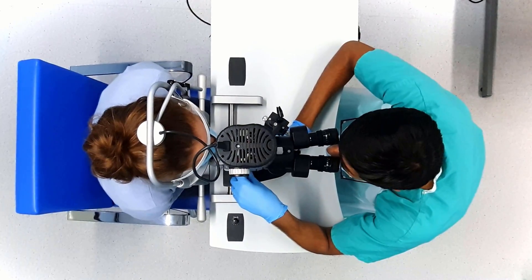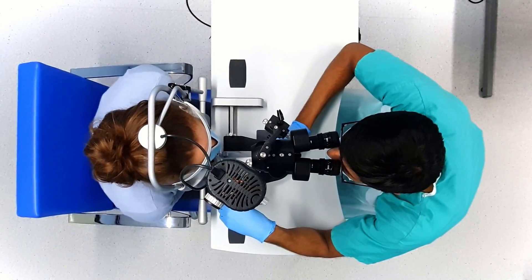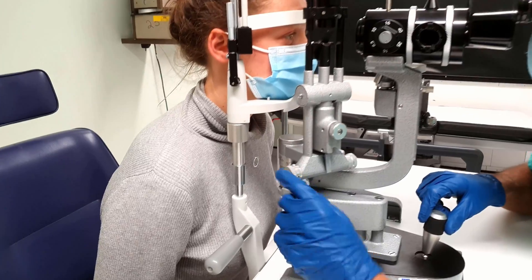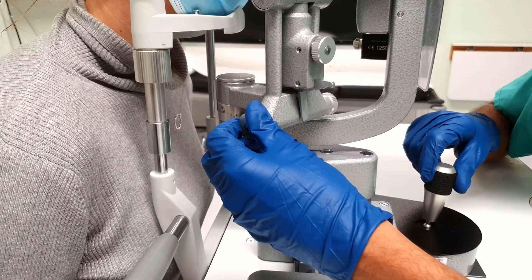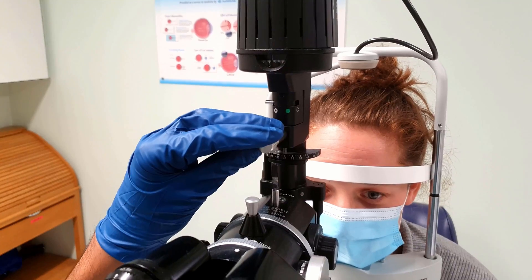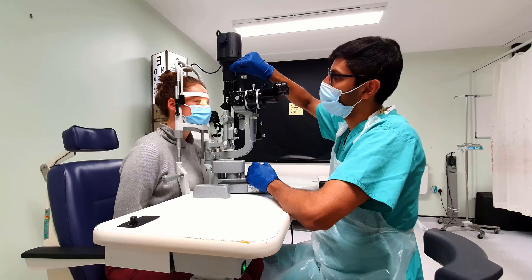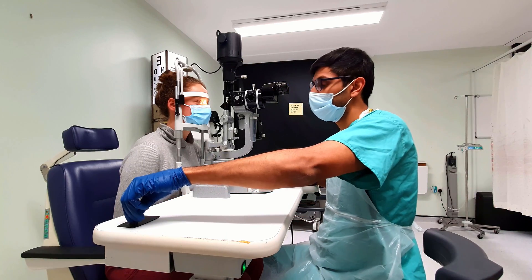Throughout this video you may see me adjusting the slit beam properties. To remind you, you can alter the slit width by turning the dial on the illumination arm. You can also change the slit beam height by adjusting this dial. Use the unfiltered white light to adjust the brightness with the dial.